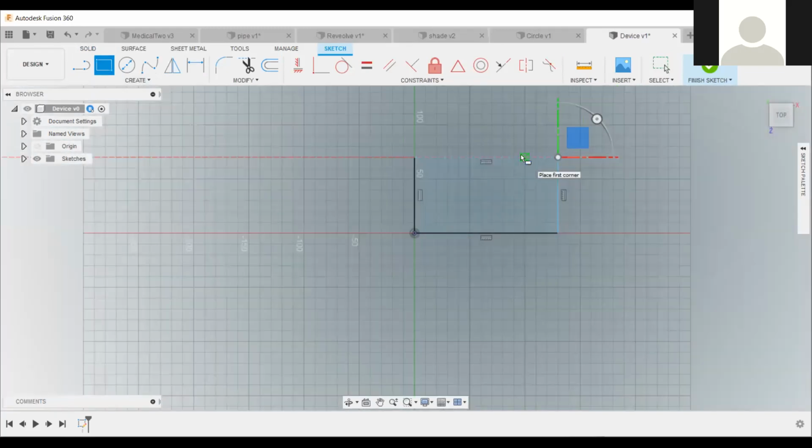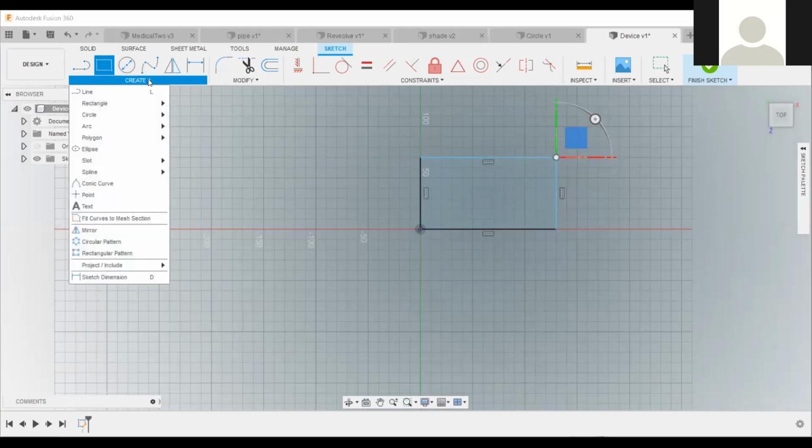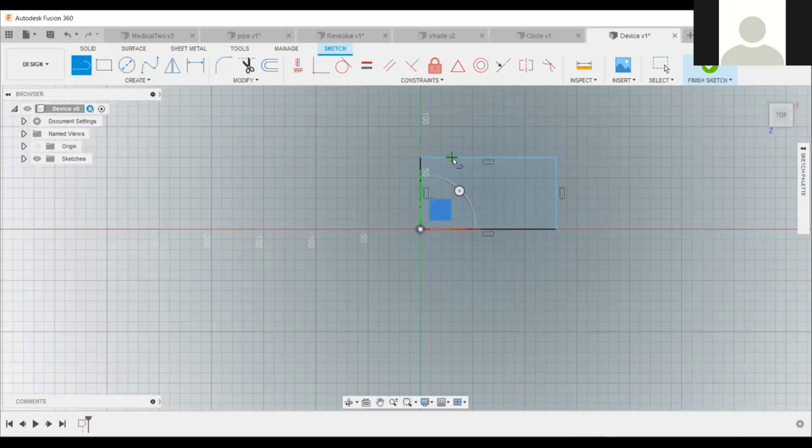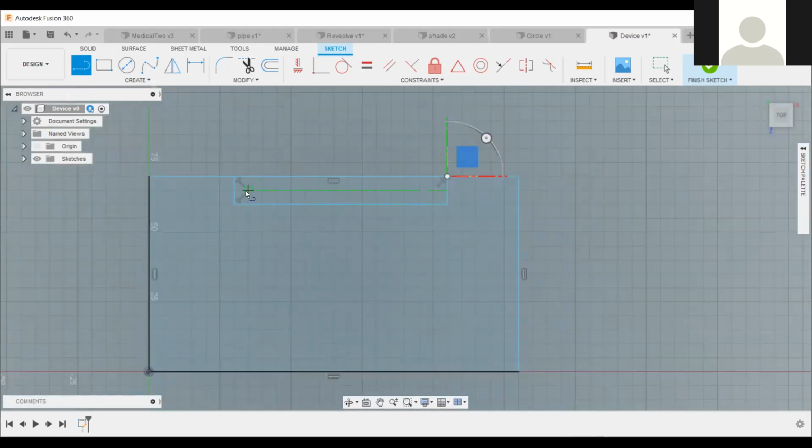So you just do something. I'm not going to make it complicated because the main idea is to show you how to assemble. But for those who are not there, we learned yesterday that you can be able to draw extra parts like that. So like this middle, this katikati. So you can measure it. So there is 10. It's okay.